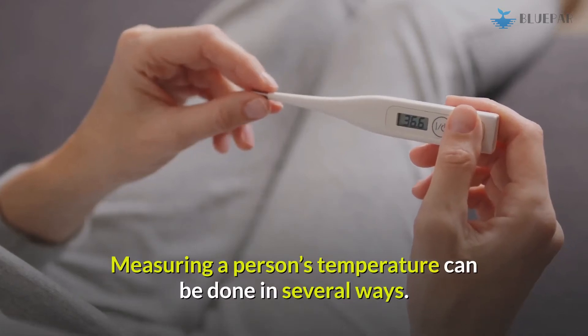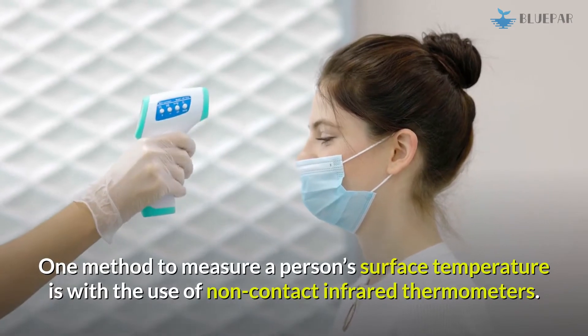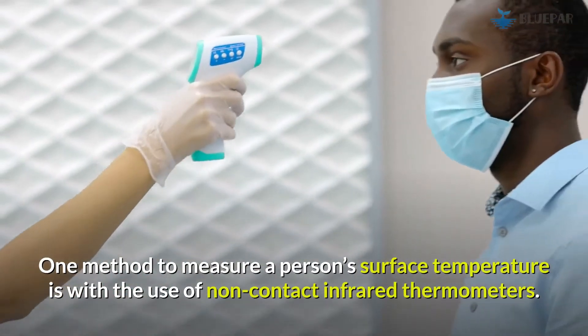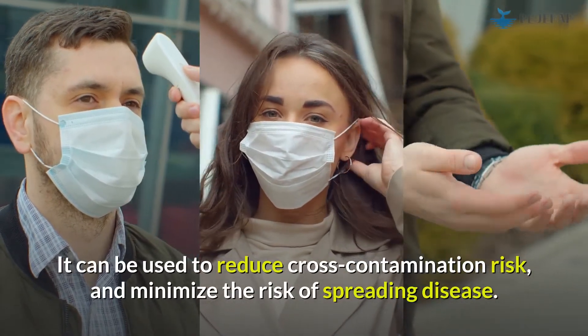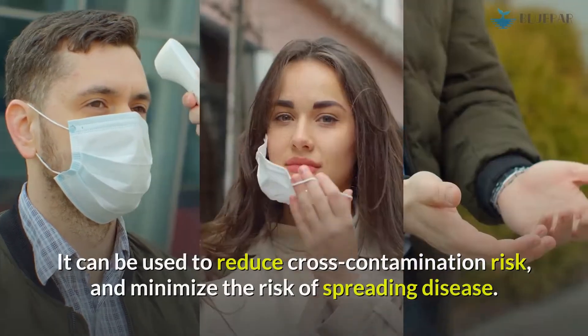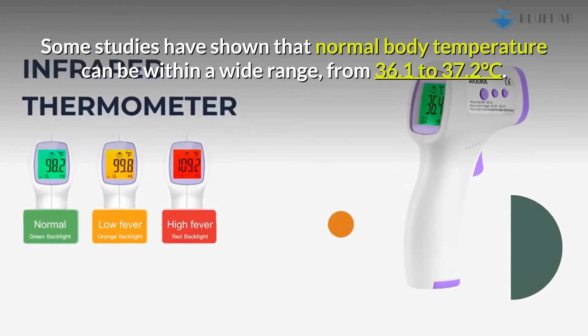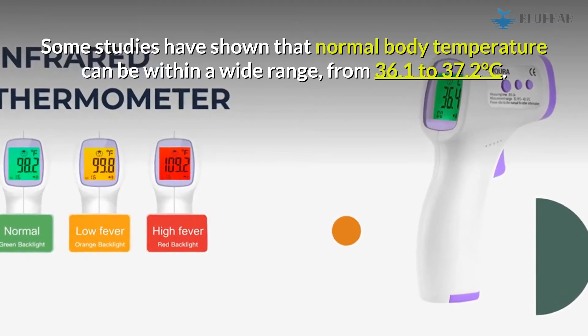Measuring a person's temperature can be done in several ways. One method to measure a person's surface temperature is with the use of non-contact infrared thermometers. It can be used to reduce cross-contamination risk and minimize the risk of spreading disease. Some studies have shown that normal body temperature can be within a wide range, from 36.1 to 37.2 degrees Celsius.